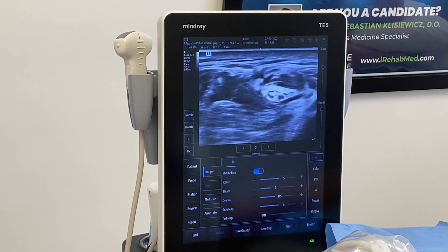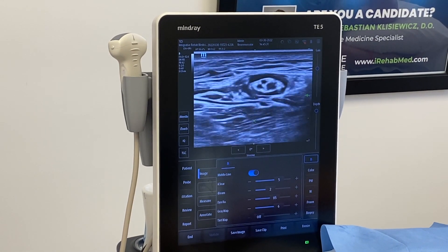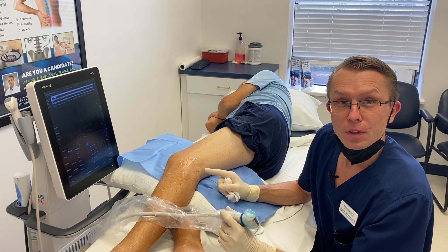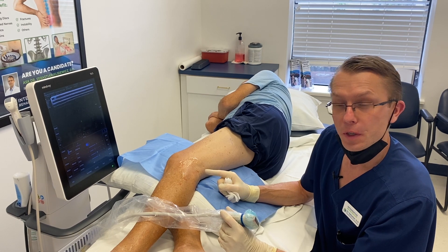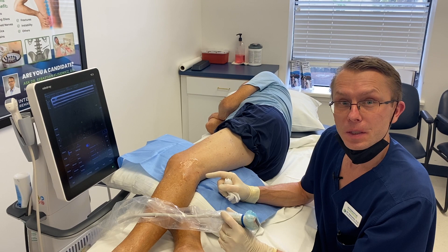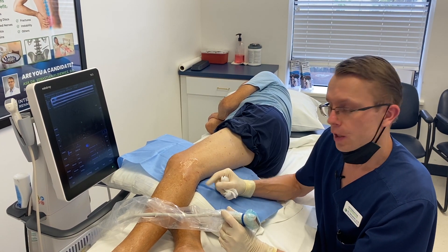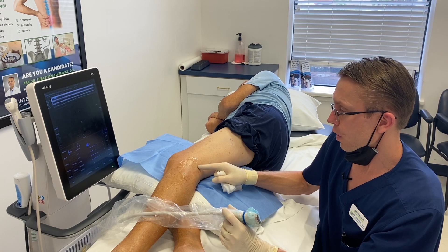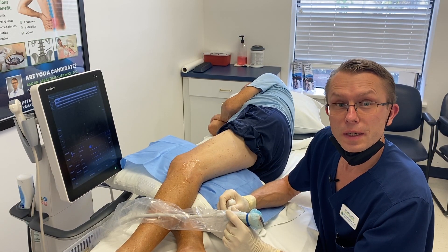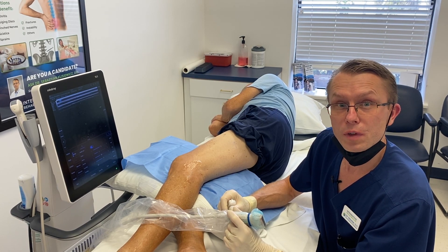I'm going to scan the nerve back and forth to see that the PRP is around that nerve and it's nicely released. Now that the fibular nerve has been decompressed, it's going to have room to heal. That's going to help him decrease the pain and symptoms he's having in his foot, allow the foot to move a little bit better. We decompressed that nerve all the way along the leg down to the knee, and the nerve is going to start healing, allowing him to have less symptoms and improved function.